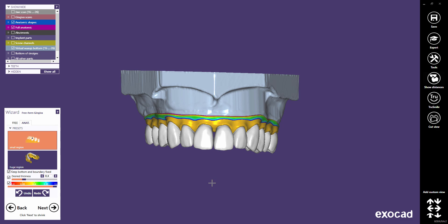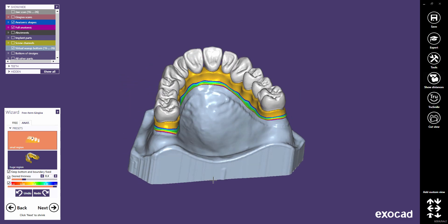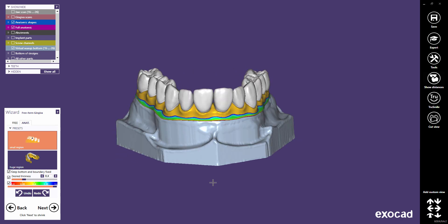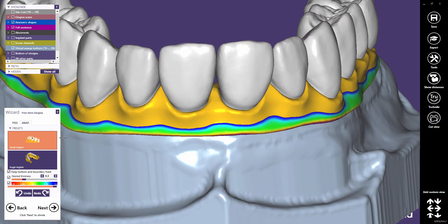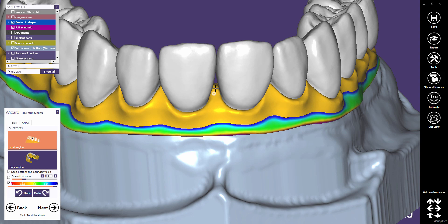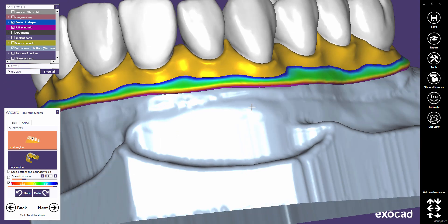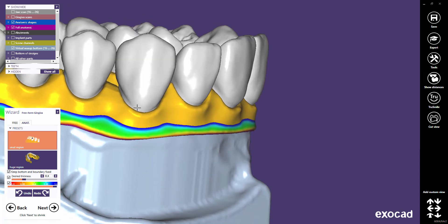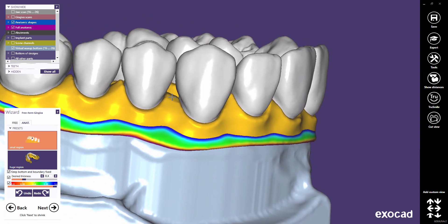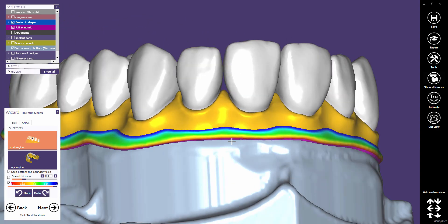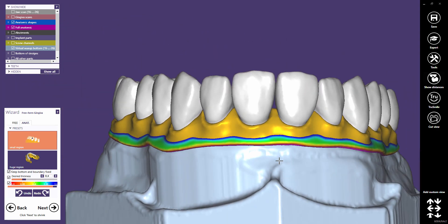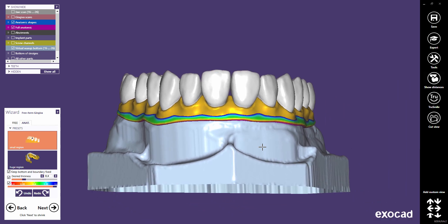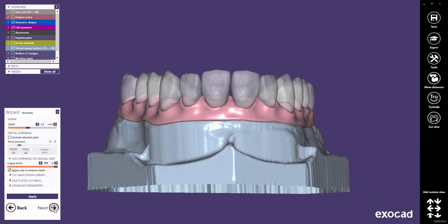Free-forming the gingiva will be explained in detail in a separate video tutorial. If required, you can do some adjustments on the gingiva design. Then proceed to the next step.